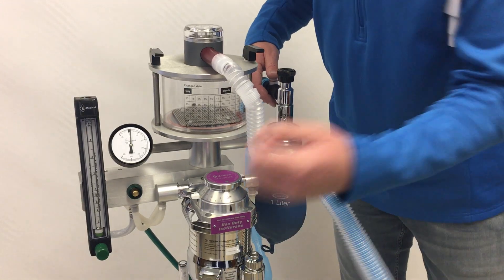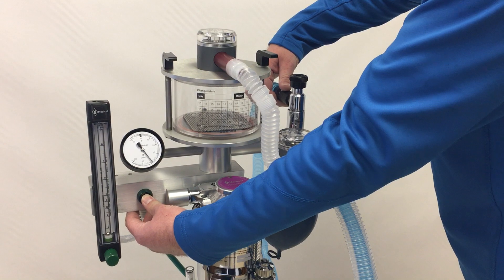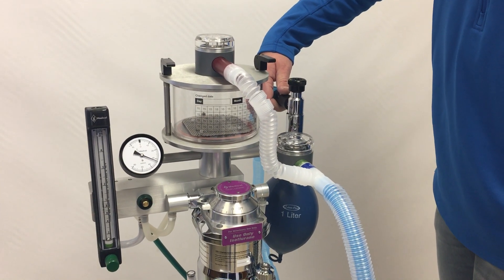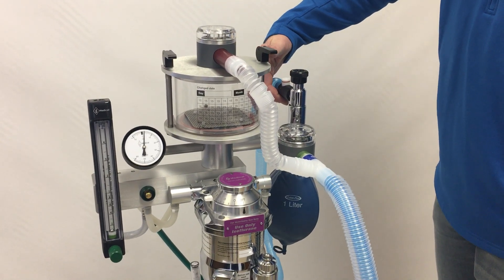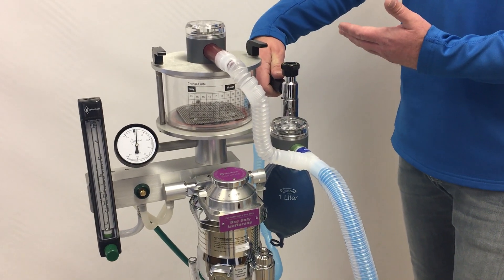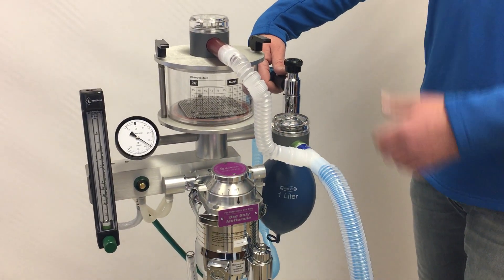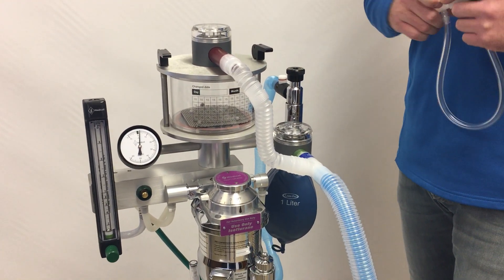We can achieve the same dangerous pressure buildup by depressing the occlusion valve. The pressure will stay up at that high level, causing injury to the patient. It's easily relieved, but by the time it's noticed, the damage may already be done — whether from someone forgetting they're holding the occlusion valve or a malfunction causing it to stick closed.